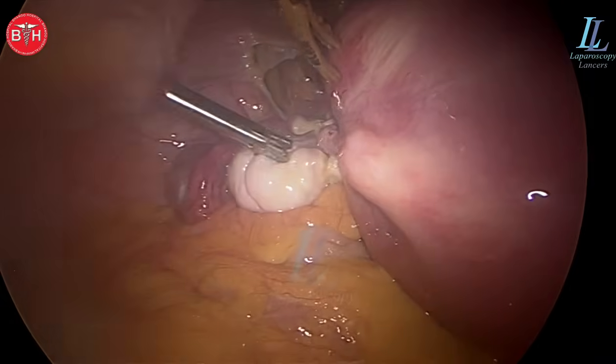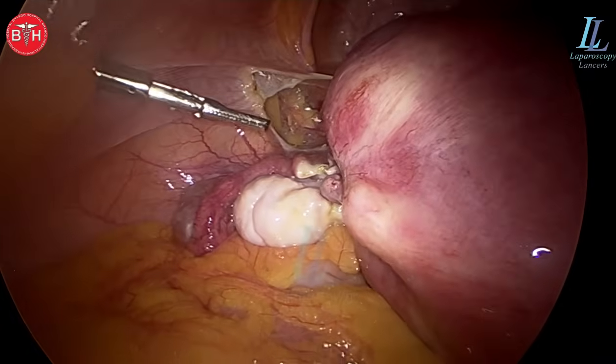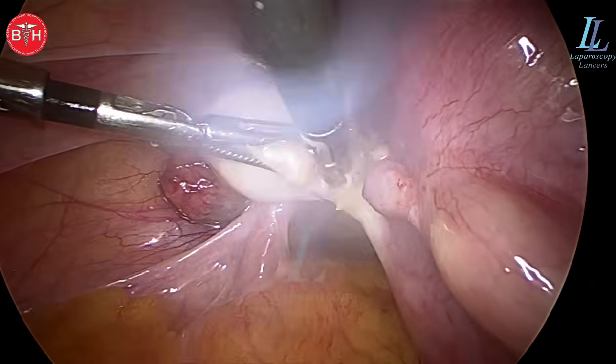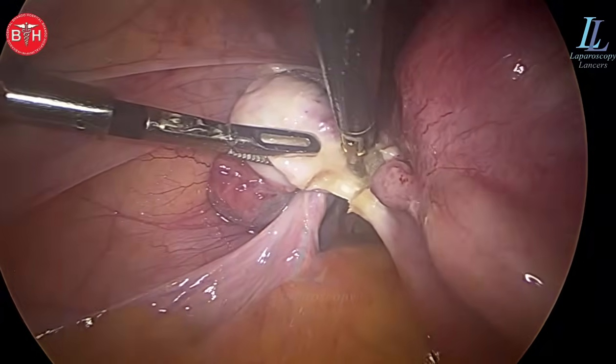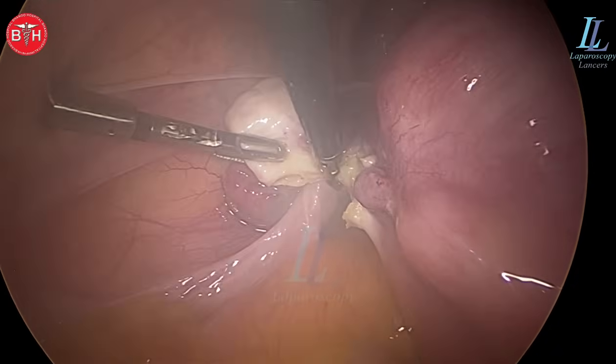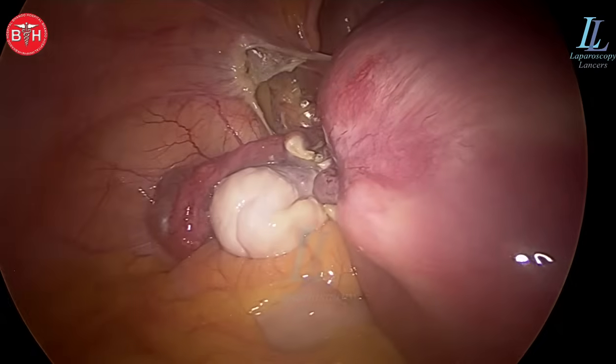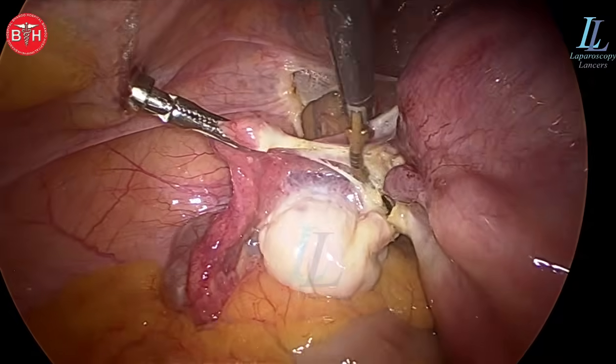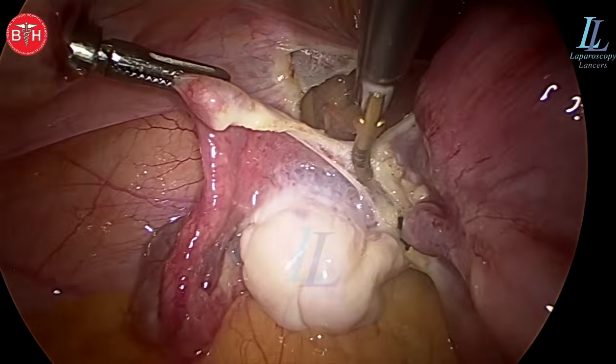She's a 55-year-old lady. We'll be doing a total laparoscopic hysterectomy with bilateral salpingo-oophorectomy. In this case, I'll not take the ovaries with the uterus as the dangling ovaries will be a bit difficult to take out. So we'll take out the uterus first and reach out for the ovaries and the fallopian tubes last.